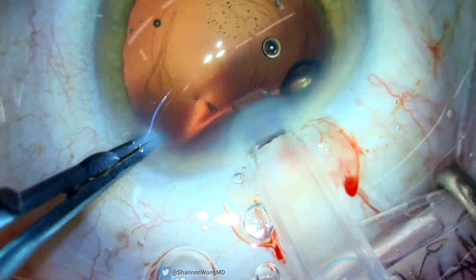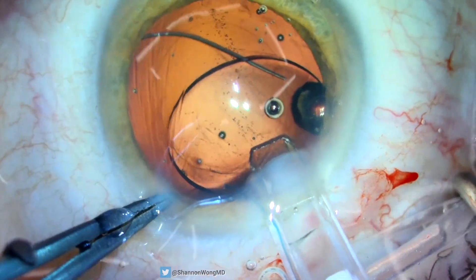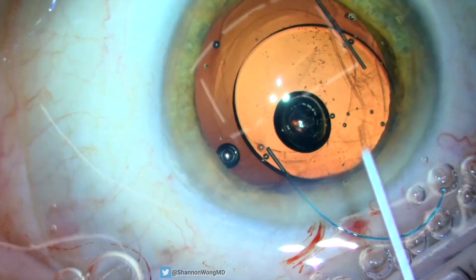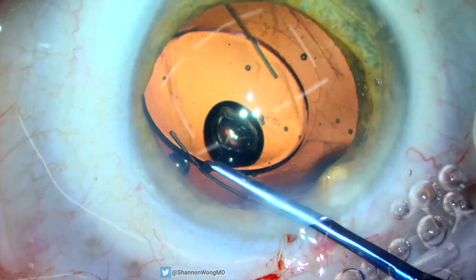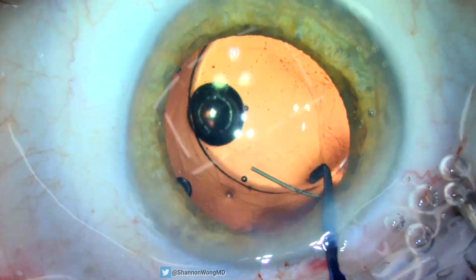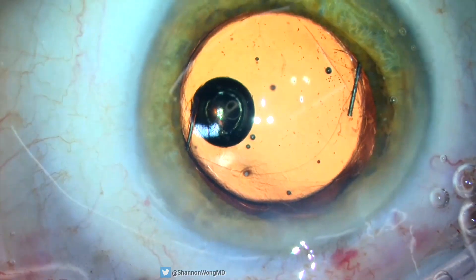The posterior capsule rupture extended to the approximate diameter of our anterior capsulorhexis. We placed our Bausch & Lomb LI61AO monofocal lens into the eye with the haptics anterior to the anterior capsular rim in the sulcus. We then pushed the IOL optic posterior to the anterior capsulorhexis in a conformation known as optic capture. IA is performed to remove the viscoelastic.